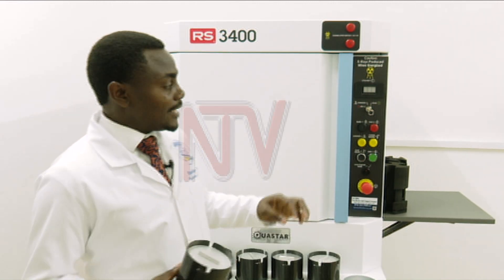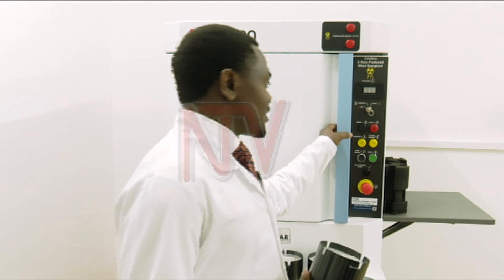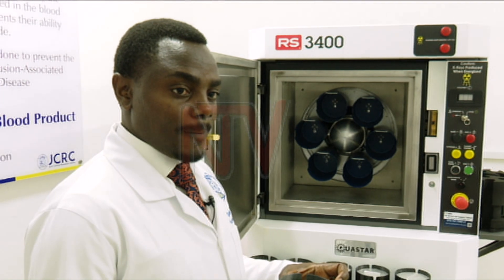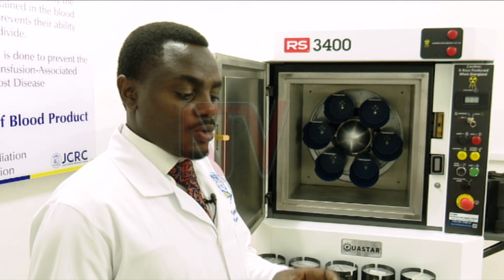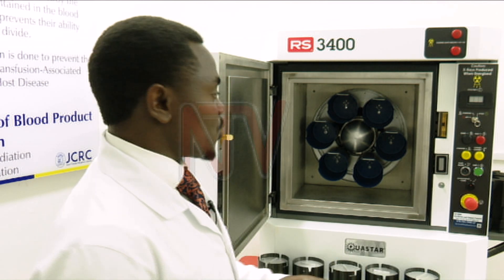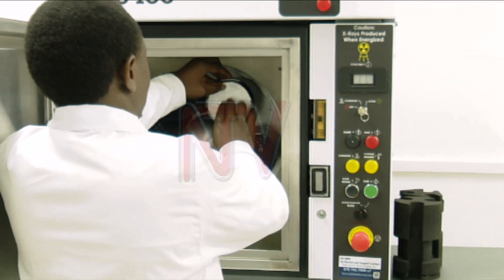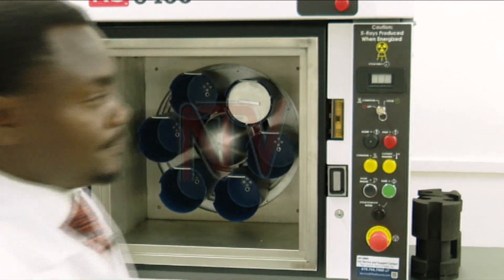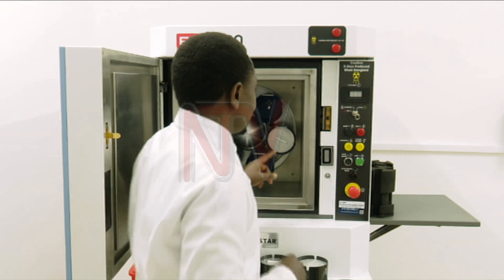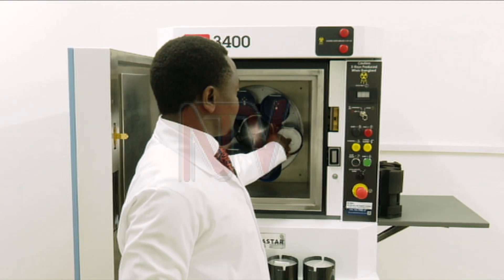When the blood is brought, it is put in these canisters. These have to be closed very well before being placed in the chambers. If you are talking about packed cells and they have come in three packets, you put two packets in one canister and the extra packet in another canister. You then put this blood into your chamber and make sure it is well locked and clipped so that the cover does not flip off.